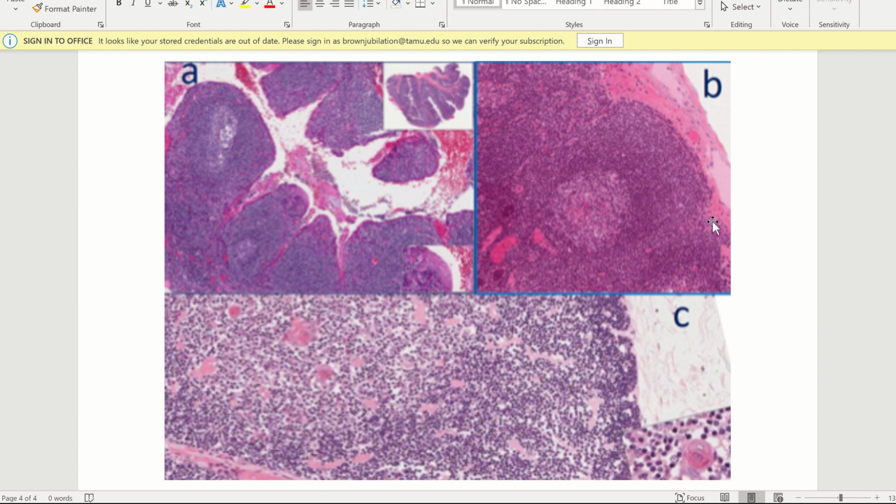The area around the follicle. So this is a lymph node, okay? And remember, that's a secondary lymphatic organ. See right here, it looks like there's this big division of connective tissue. We've got this darker staining part out here, this lighter staining part out here, so maybe a cortex and a medulla. And then if you look here, this is kind of the big hint.